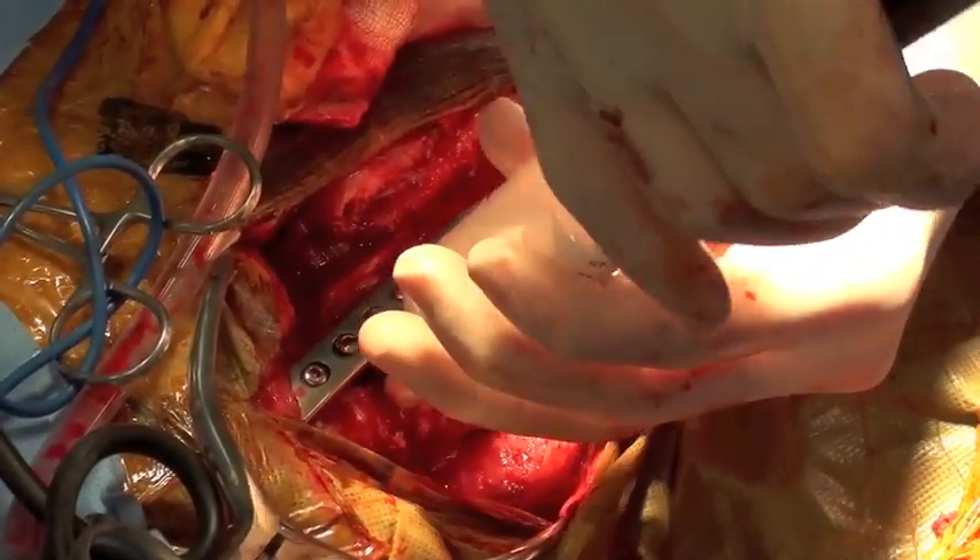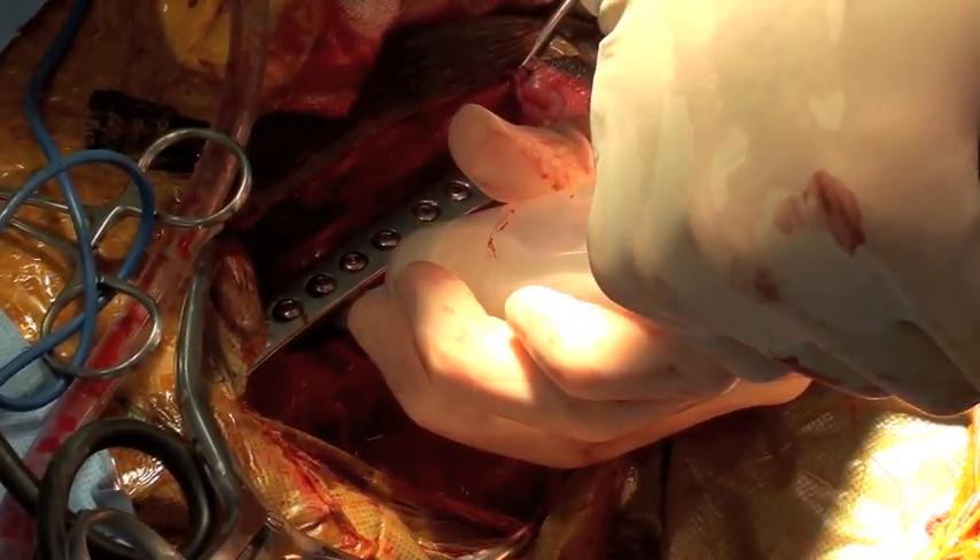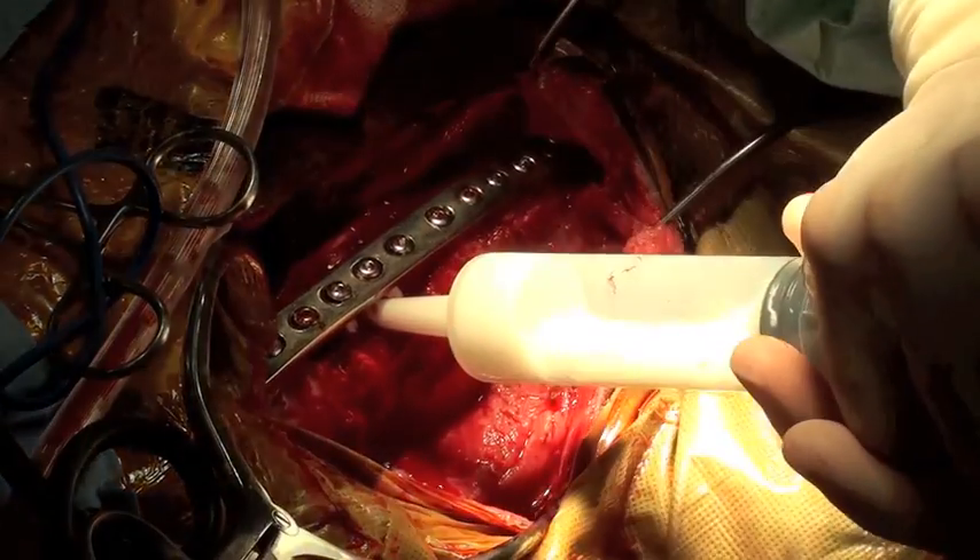Sterile bone cement is used to fill the medullary canal of the bone to provide additional support and anchoring for the screws.